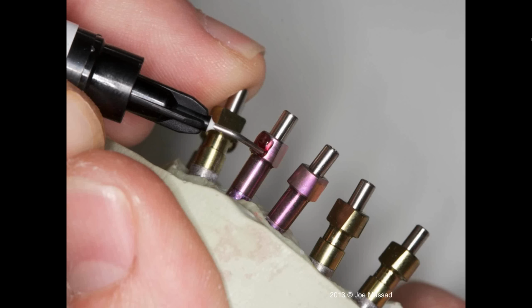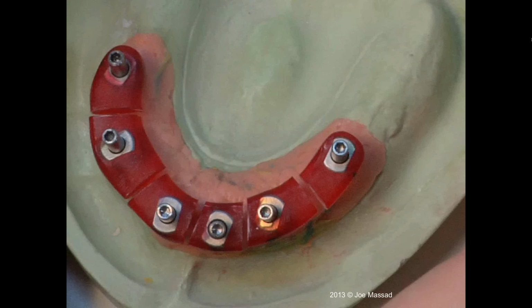So if they're really just only in front, it's maybe a little bit easier, but I like making the verification on the definitive model, and if it fits well, I don't need to cut and take another impression, but if it doesn't, I've got the option of cutting it and retaking it. So see, we actually made it in sections, and then we're going to now, this is a light curing material, and we're going to fill this, and then we're going to light cure, clean it all up. I'm putting a little excess in here right now.